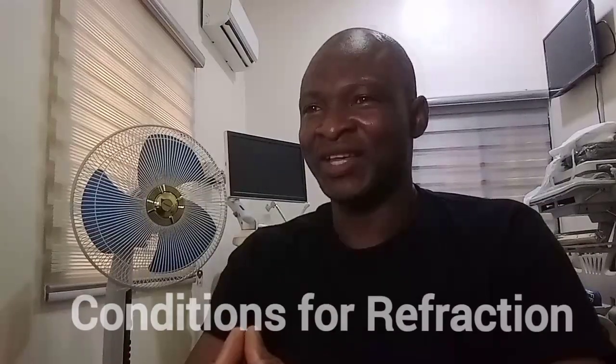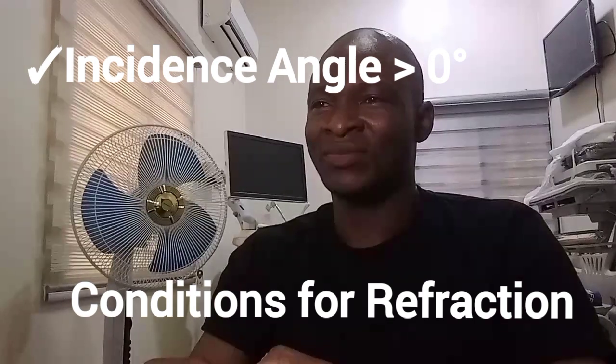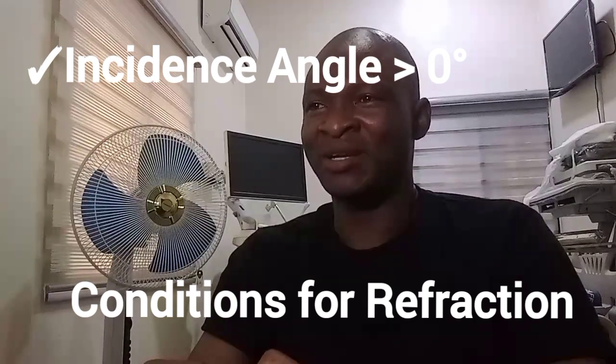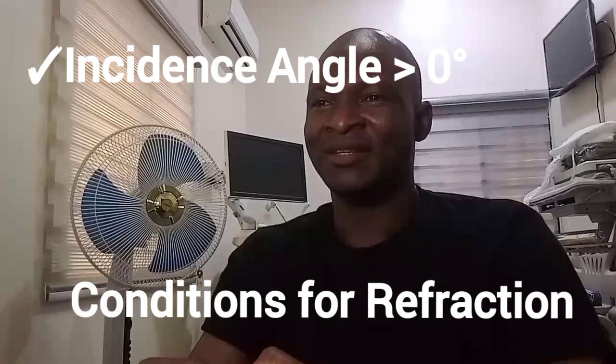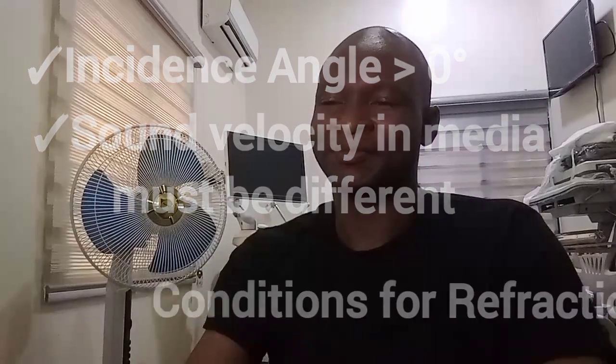So what conditions must exist for refraction to occur? The incident angle of the beam must be greater than 0. That's to say, it must be an oblique incidence. The velocity of sound between the two adjacent media must be different.